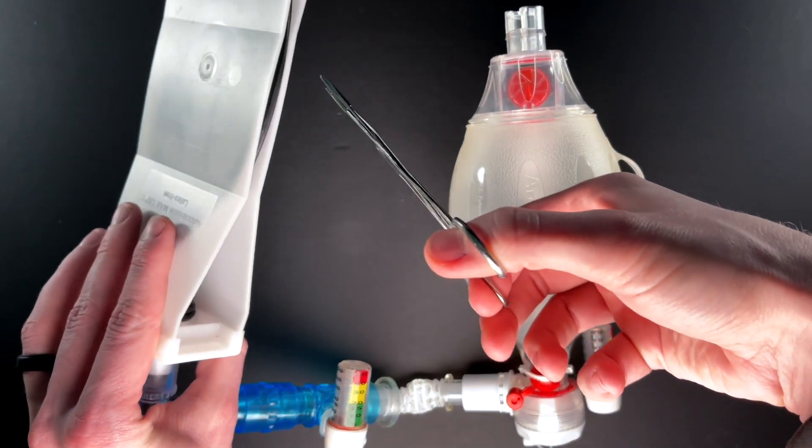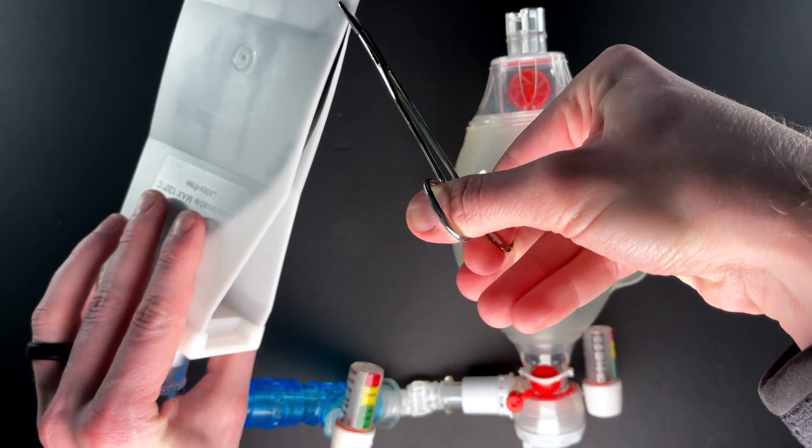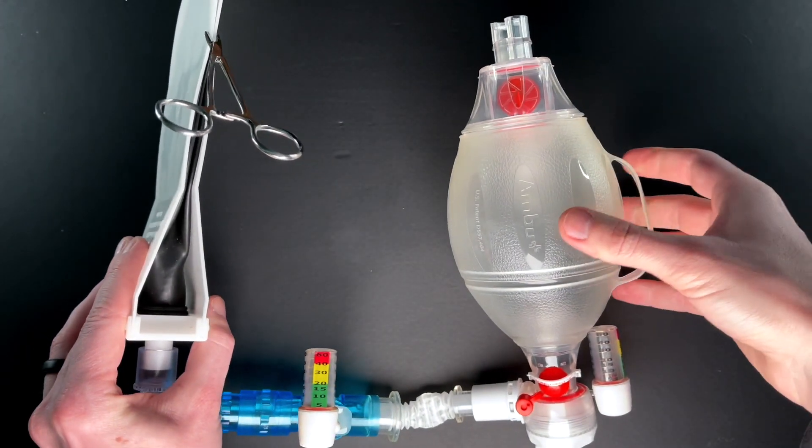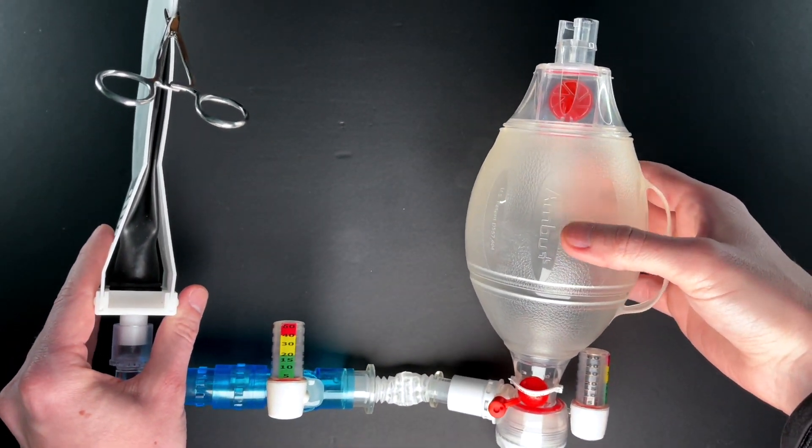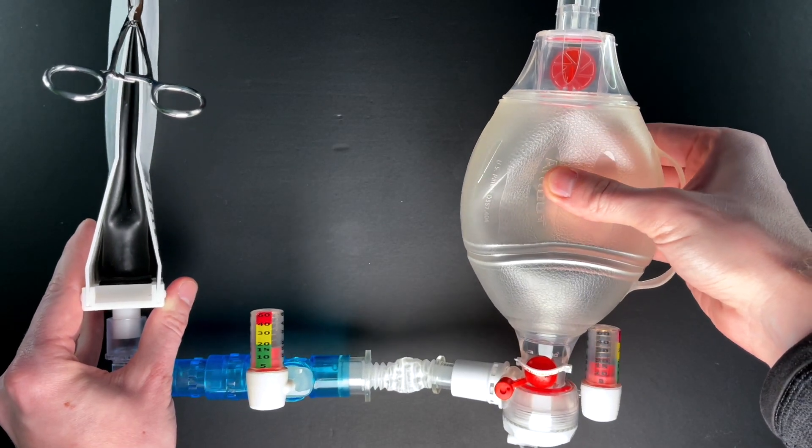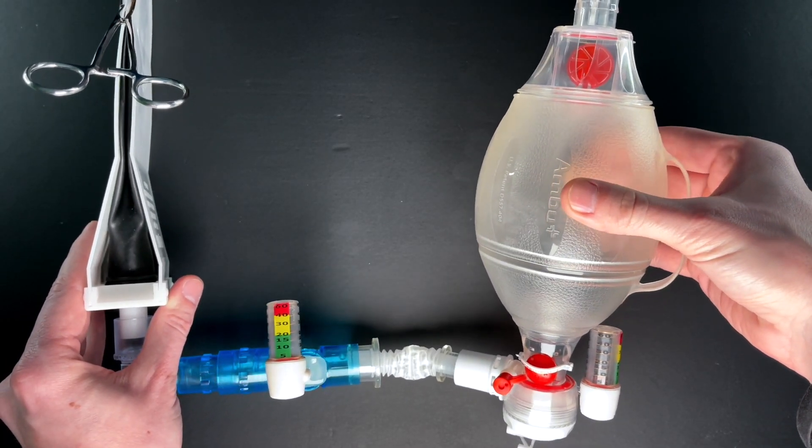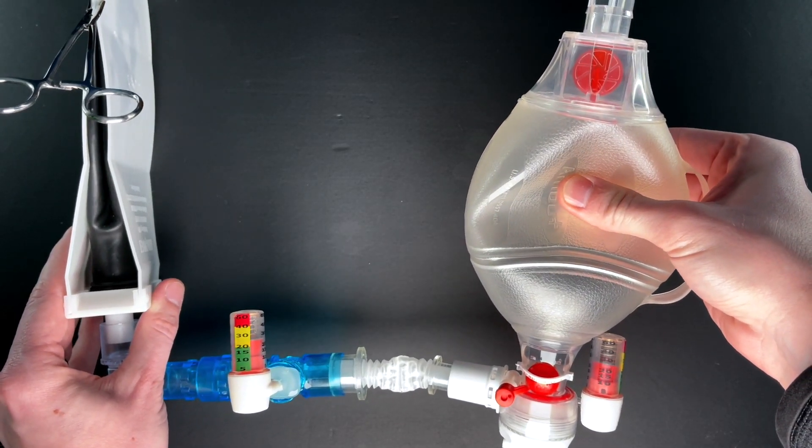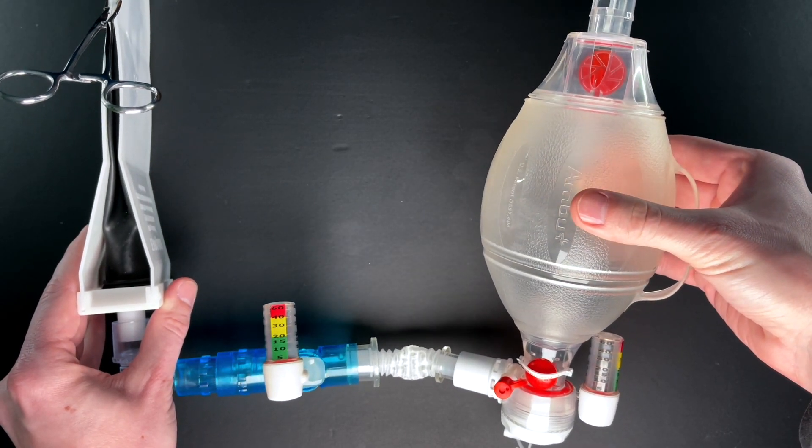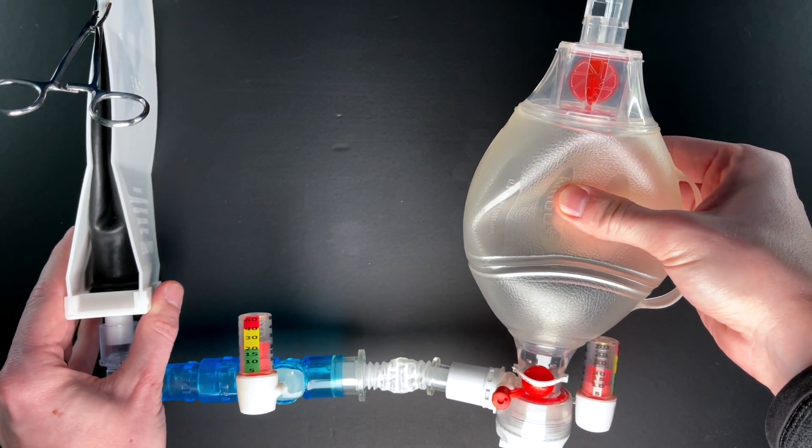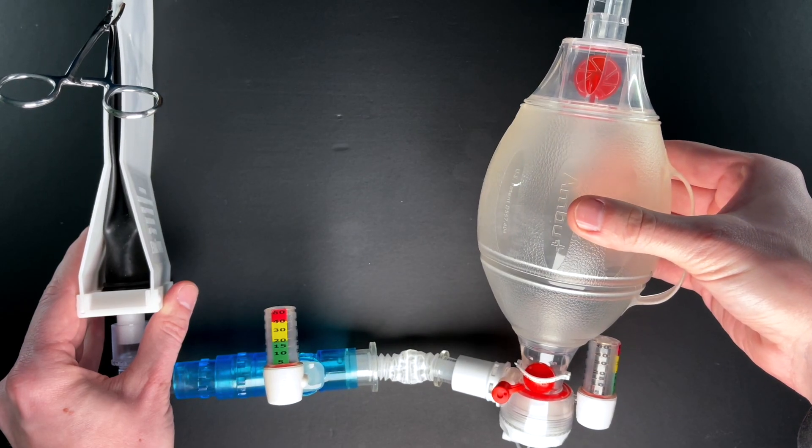But if I were to take this clamp and put it on the test lung, that would simulate a decrease in compliance. When I squeeze this, the pressure is going to ramp up really quickly. For a ventilator, if you took a plateau pressure, both the peak and the plateau would be high. There's really no escaping this pressure because it's all the way down at the end of the road.